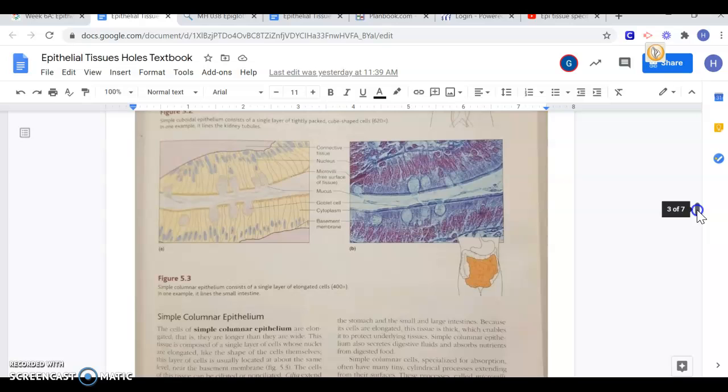Now, as I mentioned in class with this lab, usually we get out the microscopes and a whole bunch of slides, and it can be really tricky stuff. It's not easy, but I know that you guys can handle it. Just do your best and use your tools to help you find what it is that you need. So instead of using the microscope, we're going to use this great resource online to help us find all the specifics that we need.